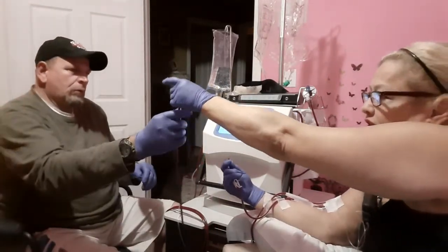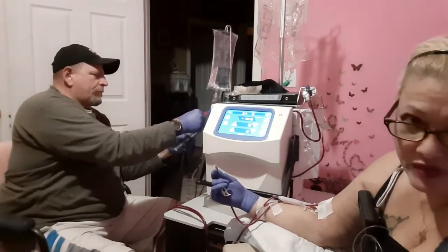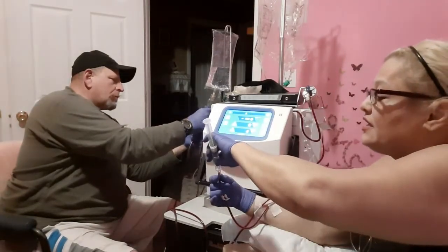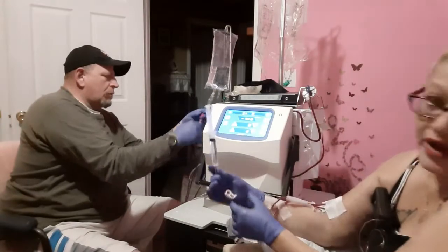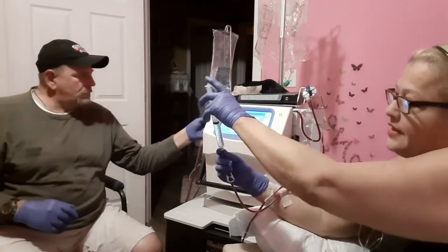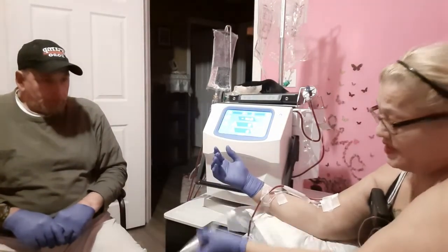Okay, disconnecting the red. Huff's is going to clamp. It should already be clamped. He's going to remove the syringe with the 10 mil. Okay, and he's going to connect the arterial, and then he's going to unclamp that clamp over there. So, I have my syringe at the end of my syringe line. I'm going to unclamp and flush the arterial and clamp. Okay, so I'm done with that.